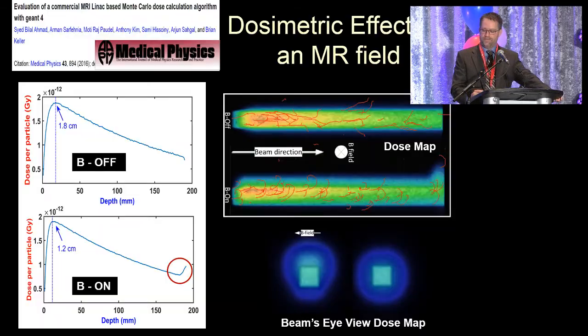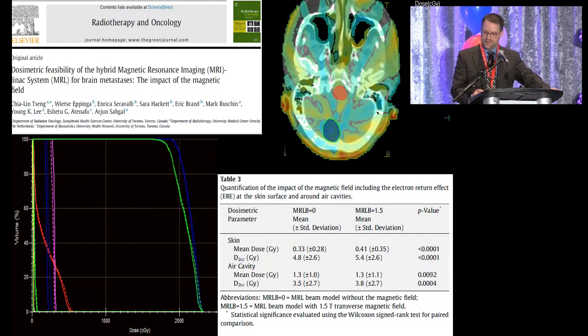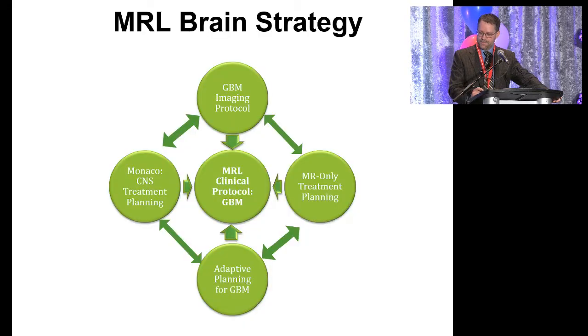So what had to happen? First, again, we had to understand how the radiation can be delivered in this field. Our physics department has been instrumental in understanding what happens with these beams and what happens with the radiation dose to patients in a magnetic field. With that, we've been able to model. My colleague, Dr. Seng, led this as part of his work, both at Sunnybrook as well as in Utrecht in the Netherlands, to model what would happen to patients treated in the MR LINAC. The modeling all shows that it can be delivered safely and highly effectively.